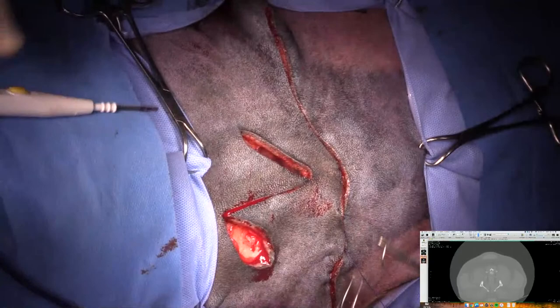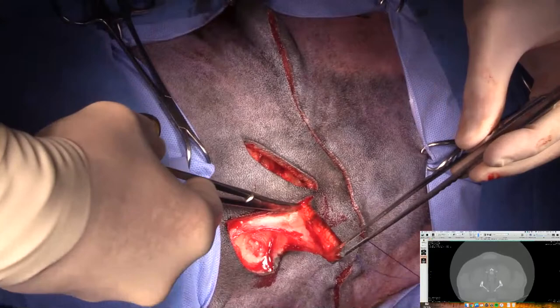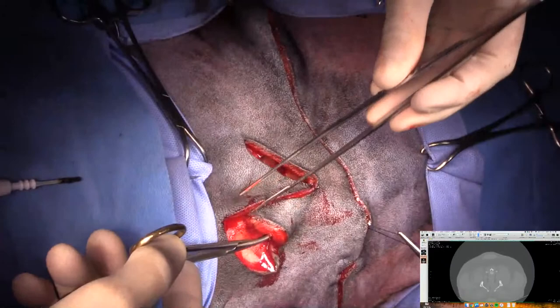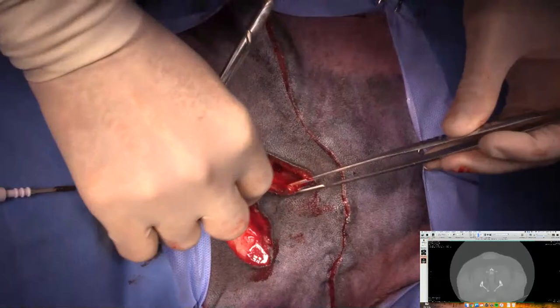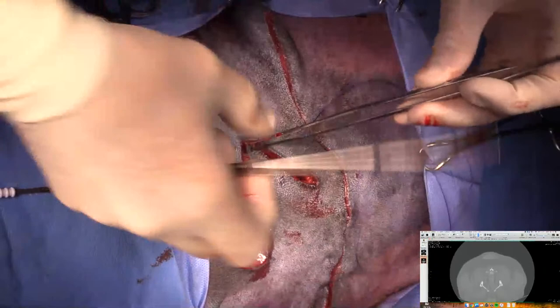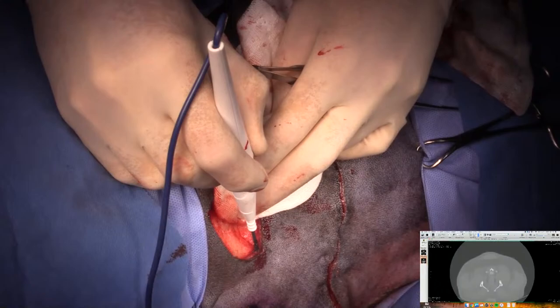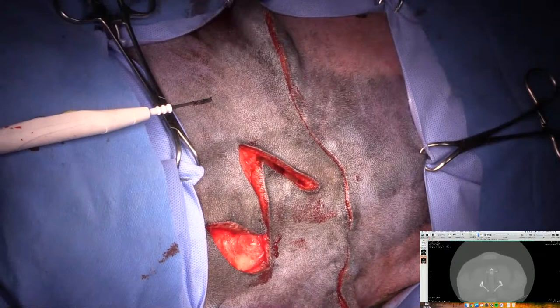When you're doing your Z-plasty, you have to make sure that you totally release these ears so that the skin is mobile. And then bring them across like this. Can we get some 2-0 PDS, please? And that's under much less tension now.